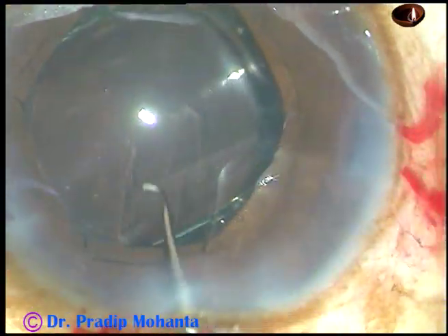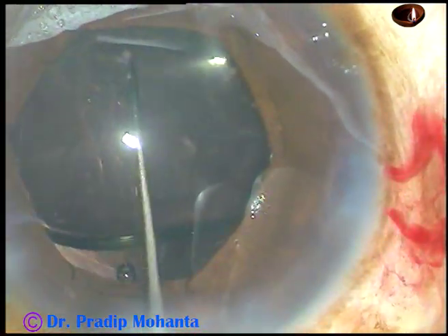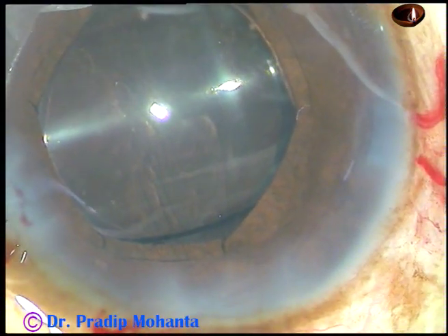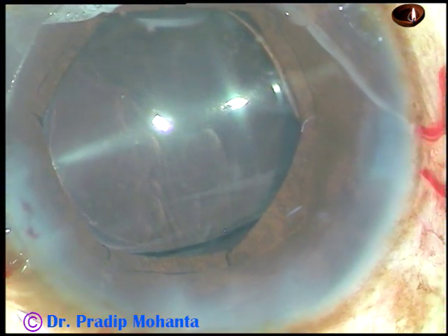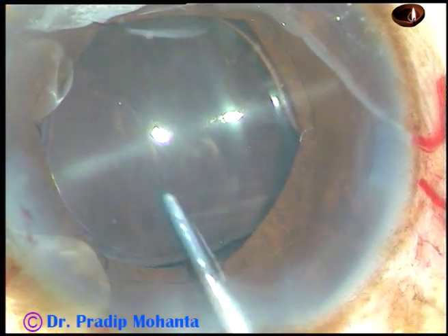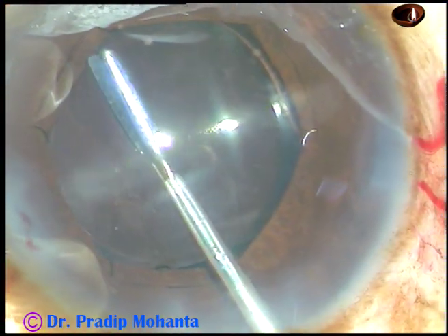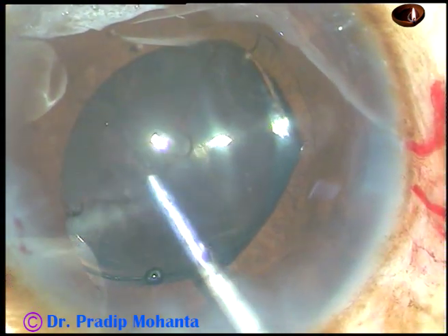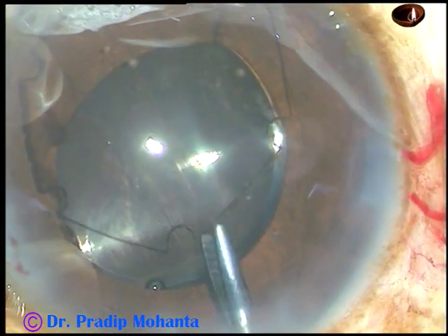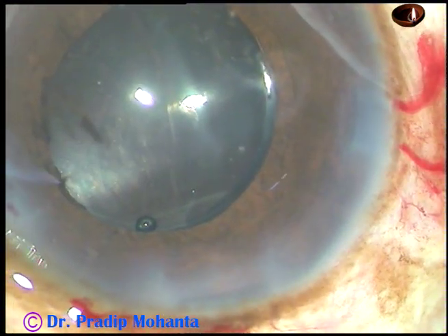Otherwise, if the haptic is over the iris as you dial, the pupil expansion device may get dislodged. To avoid dislodgement of the pupil expansion device, this is the technique. Now how to remove the device: hold it, pull it, untuck all the flanges, and just pull it out. Very simple.